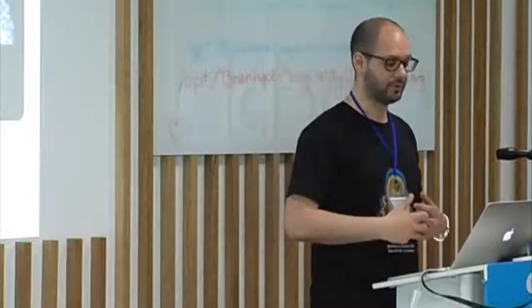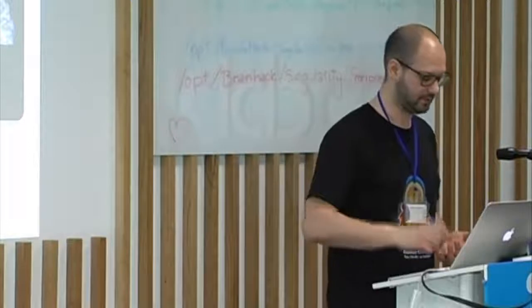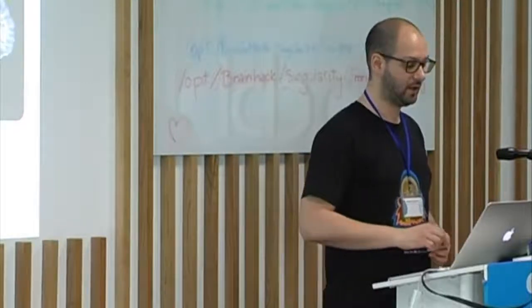Another thing that you know from anatomy is that the corticospinal tract should go through a very narrow area, which is the so-called internal capsule. So you actually put a waypoint area, a waypoint region of interest, ROI, and you extract a much better, much more reliable picture of your corticospinal tract out of your single subject, like in this case.